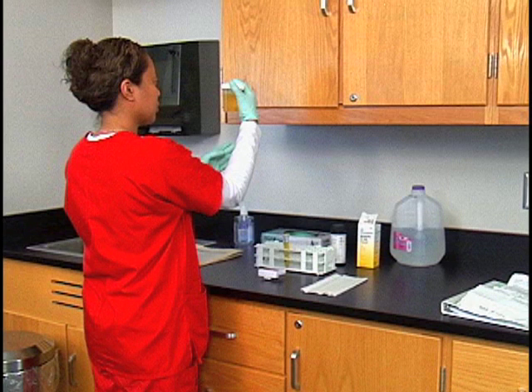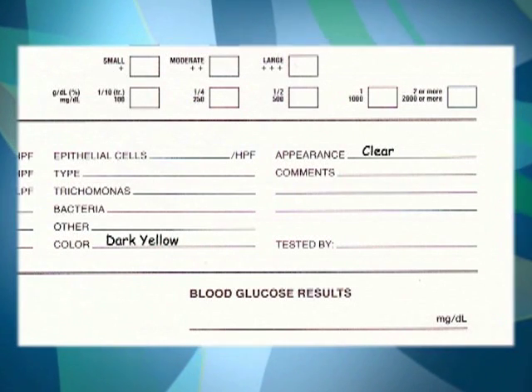Now assess the appearance of the urine specimen. The appearance of this urine specimen is clear, which is normal. Chart these results.